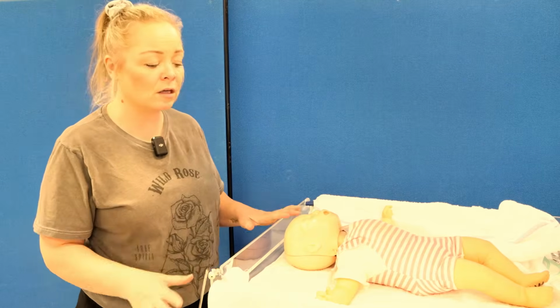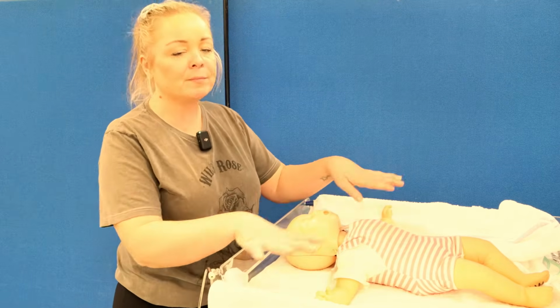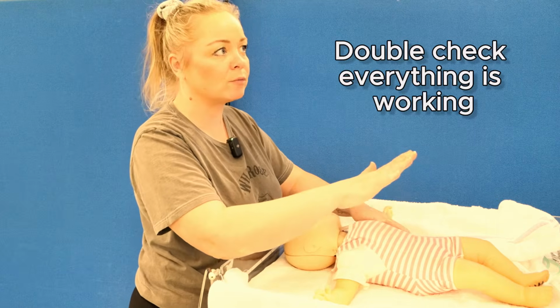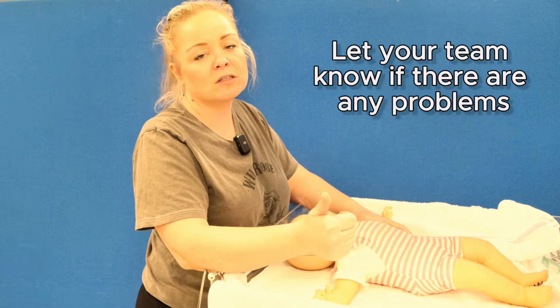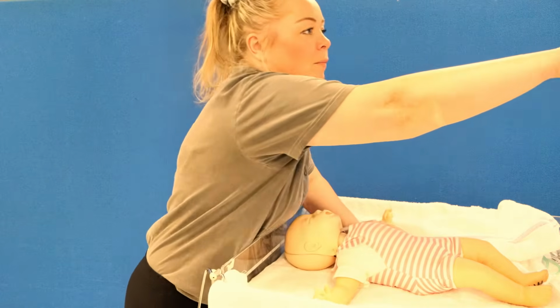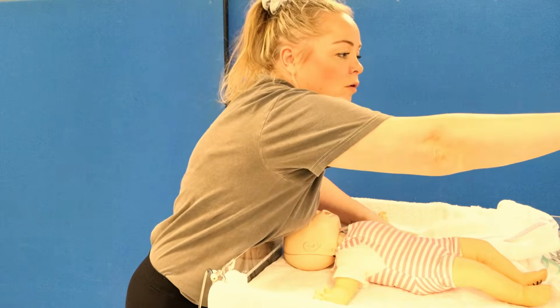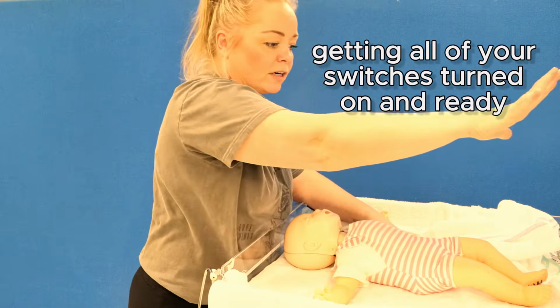So what we did first, we came into the room and baby had been placed in the resuscitator. Your resuscitator checks would have already been done in the morning, but just double check that everything's working and let your team know if there are any problems. So power on, heat on. We want to get as much heat onto baby as we can. Getting all of your switches turned on and ready.